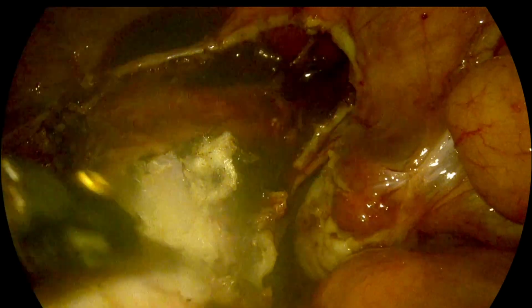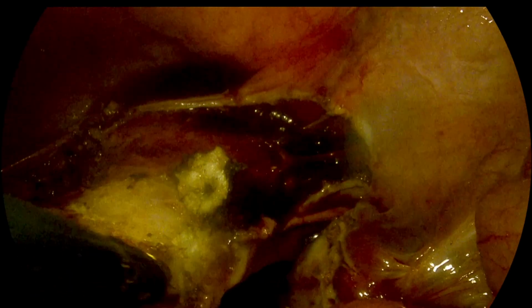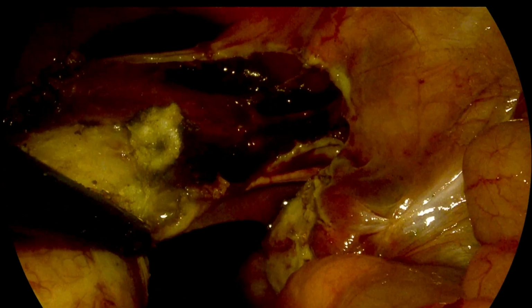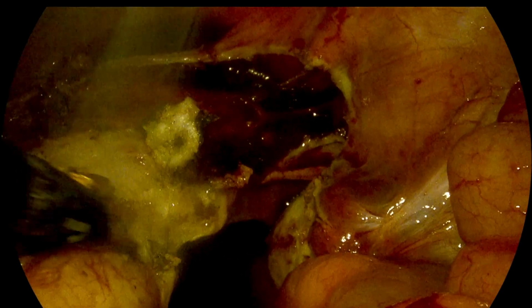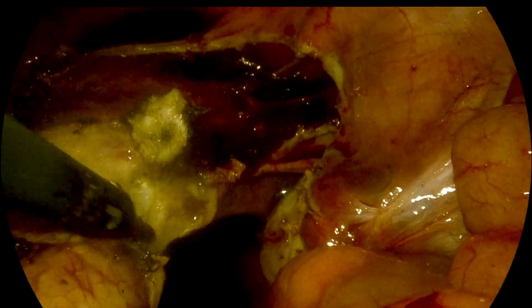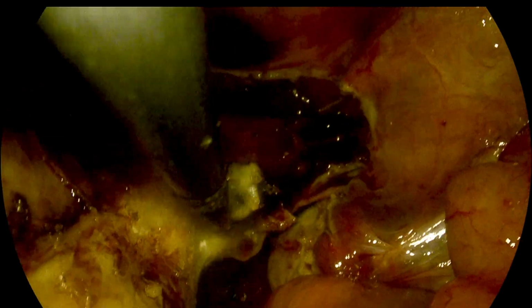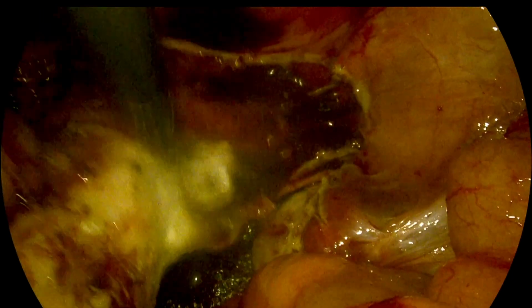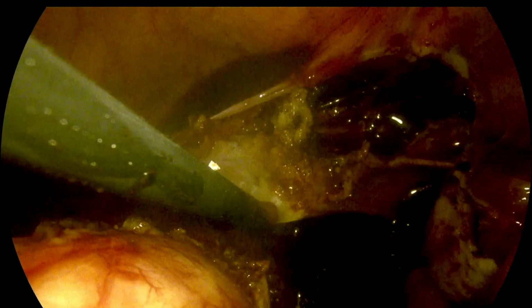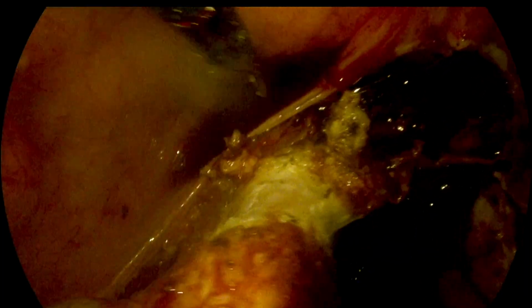Now that is the uterosacral ligament. We are dividing it. That is pulled well above the site of the uterine vessels. Normally we see the uterosacral ligament well below the site of the uterine vessels, but here in this case it is pulled very high. So that may be the reason why we are able to identify the uterosacral ligament a little superior to the uterine vessels. So now, even on the right side, the surgery is complete.